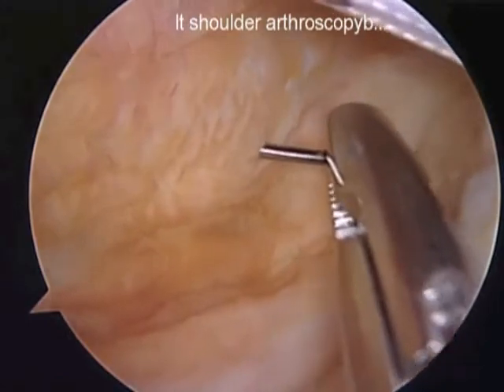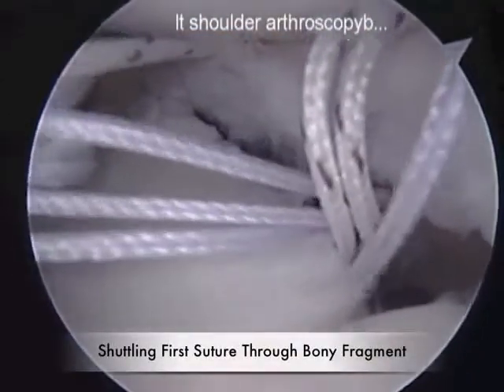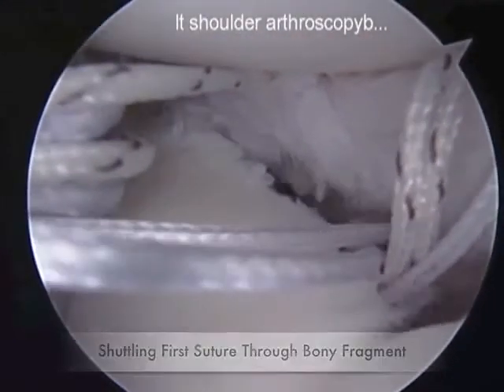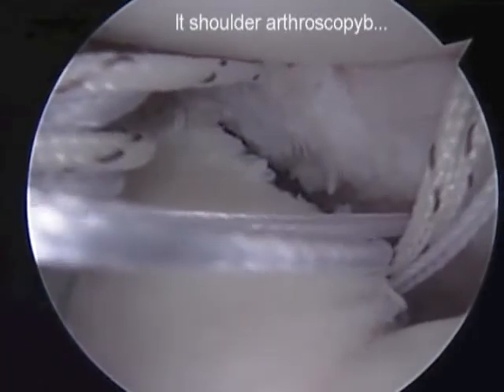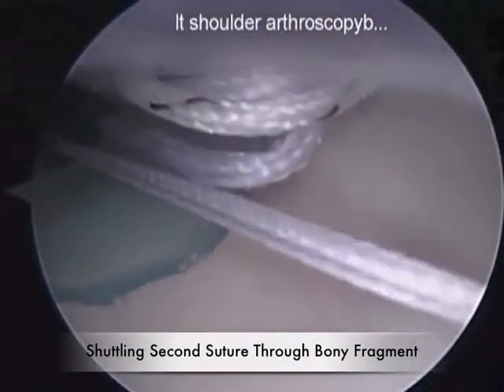fragment. These same steps are repeated for the second suture, and the two sutures are now in position to secure the bony fragment. Due to the small size of the bony fragment, we elected to remove the second suture from the anchor prior to tying.